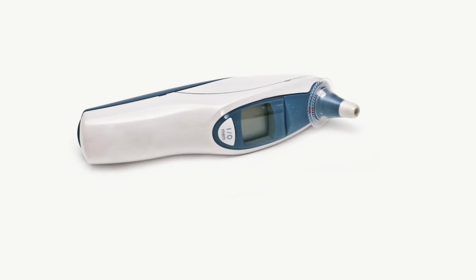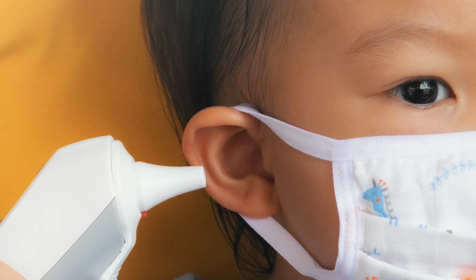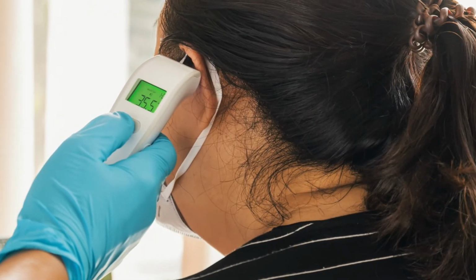And the fifth, the last and not the least, and actually the most useful one, is the ear thermometer. The ear thermometer is something like this, and the advantage is that it's very convenient to use, and we can use it from a wide range of age groups, right from 3 to 6 months of age to adults and even old age. Another advantage is that it shows us almost near the core temperature. The ear temperature will give almost near to the core temperature.